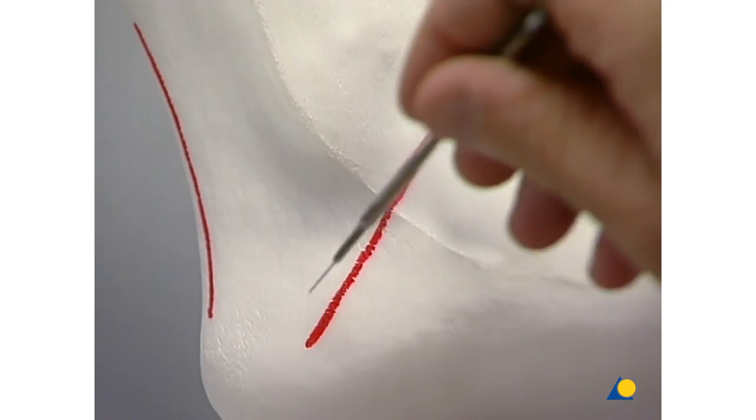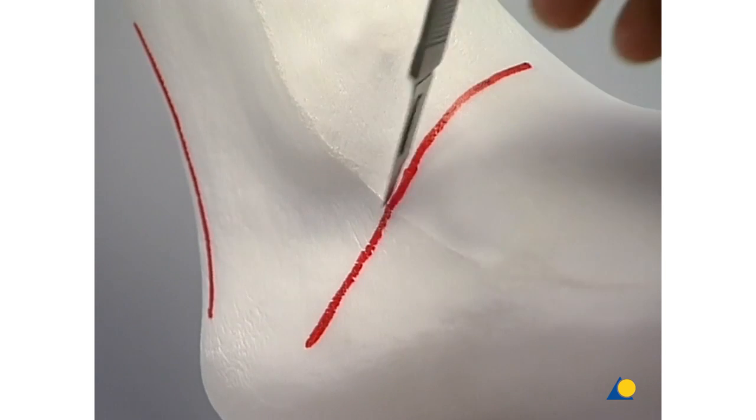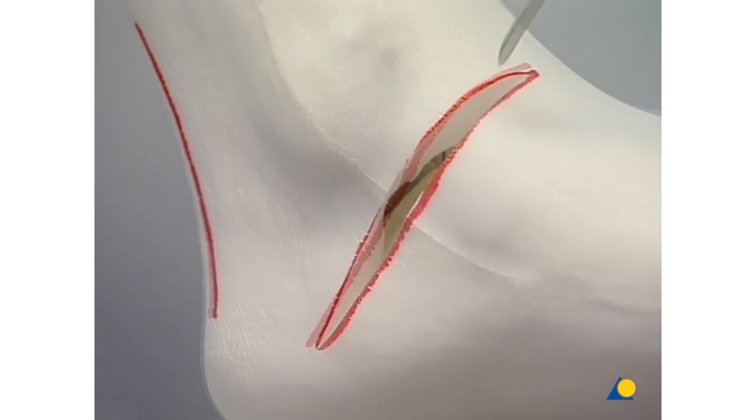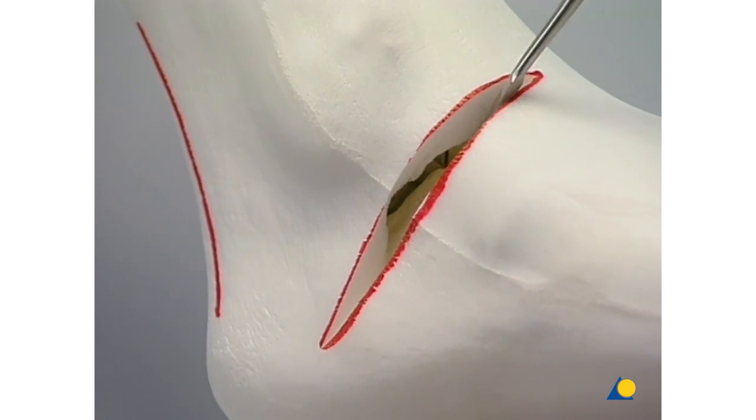Incision of the soft tissue layer and mobilization with the small periosteal elevator.